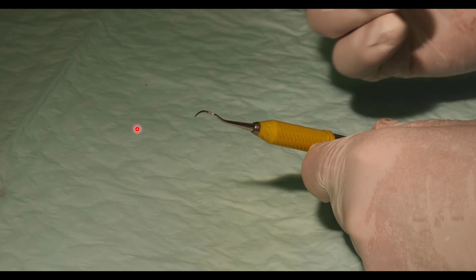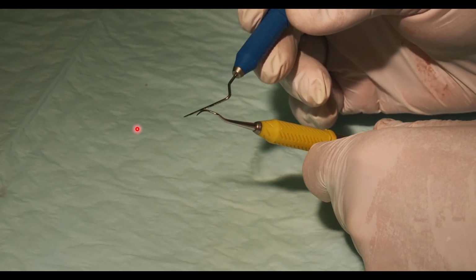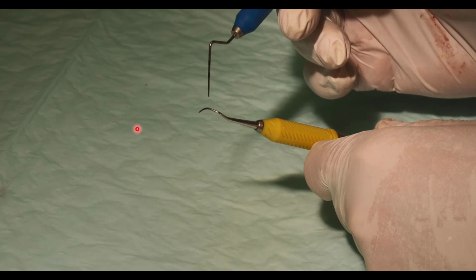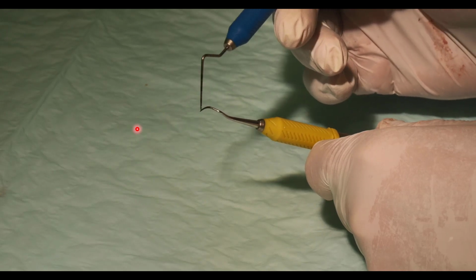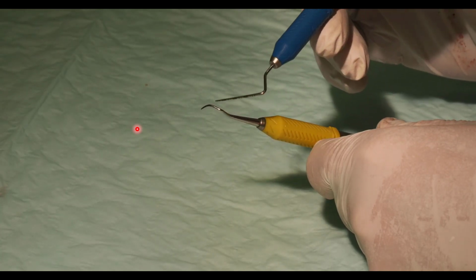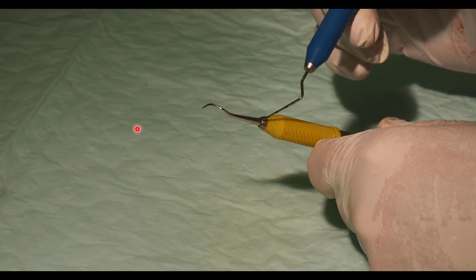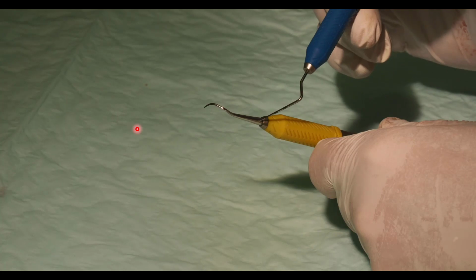This is a curette. A curette is not triangular, it's more rounded. So it has a blunted tip and a blunted back. Curettes are what we're going to use below the gum line. You could use it above the gum, but they're more expensive and more difficult to sharpen. So I use these under the gum, and you generally only use one edge as a cutting edge because the other side is against the gingiva. Curettes also have an accessory bend for the most part. They do make straight up and down ones called universal, but the Gracey curettes have this accessory bend. And as we're going to see when we get to the actual subgingival hand scaling, this allows your hand to stay out of the mouth while you're getting up underneath the gums.